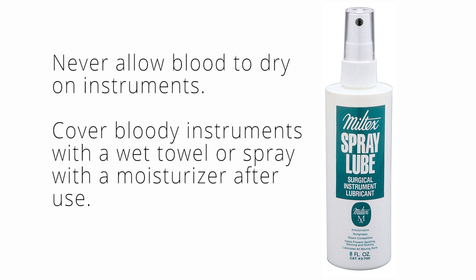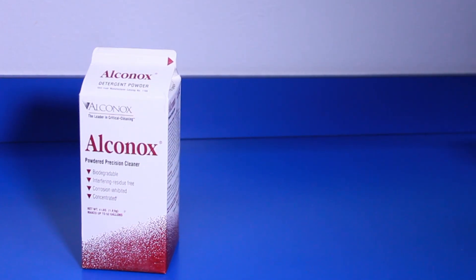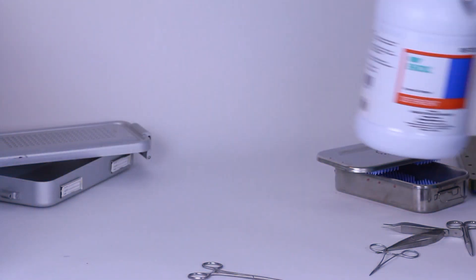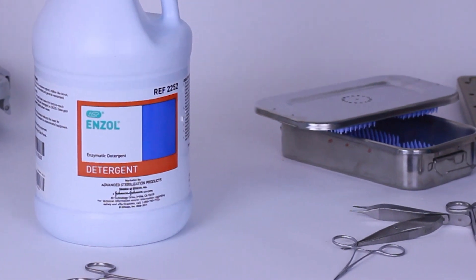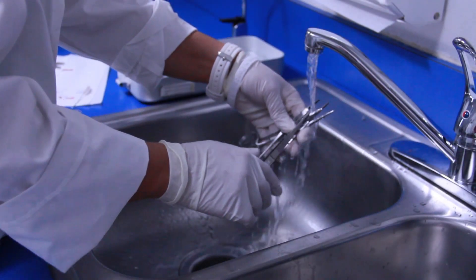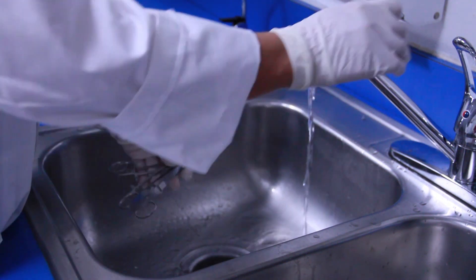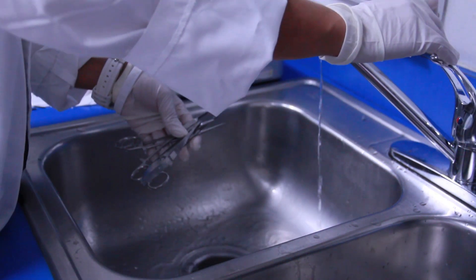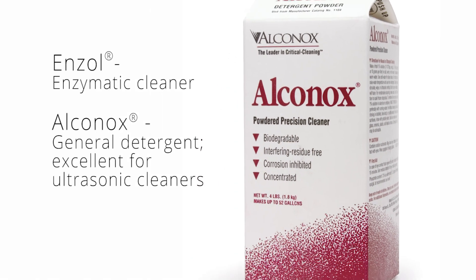Spraying the instruments with a moisturizer is an effective way to prevent blood from drying. You can clean surgical instruments manually or mechanically using water and detergents. An enzymatic detergent is helpful for removing biological contamination on instruments. Thoroughly clean your instruments because any remaining debris can interfere with further sterilization and can corrupt research data. For best results, use a detergent like Enzol or Alconox.